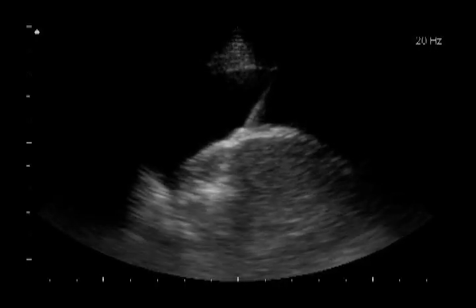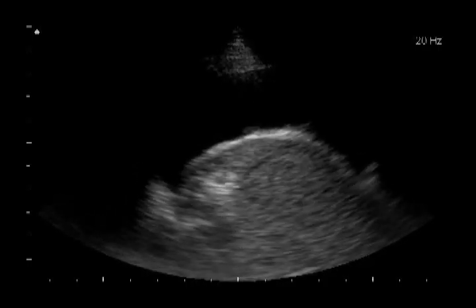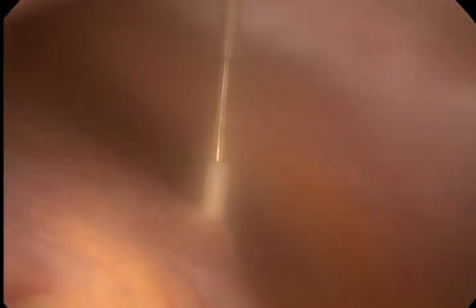Microwave energy is then turned on. In this case, we treated the tumor with 80 watts for 6 minutes. Once the microwave process is completed, the needle is withdrawn under direct thoracoscopic visualization and hemostasis was assured.